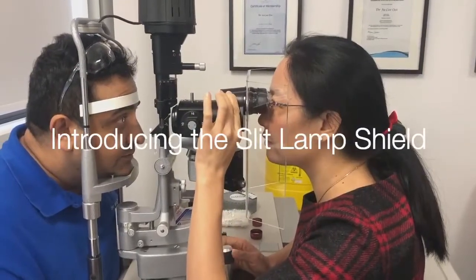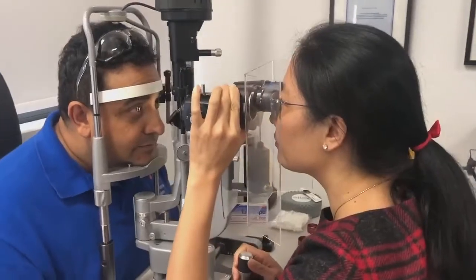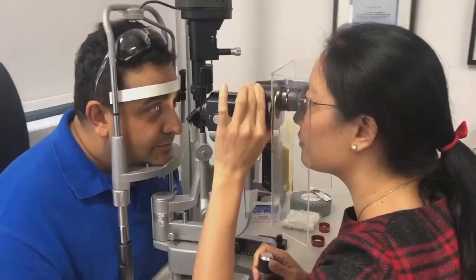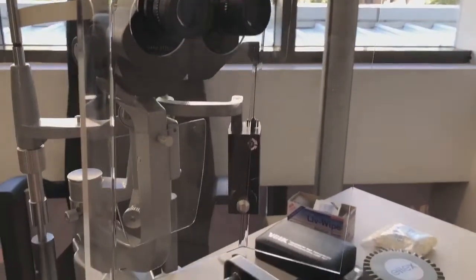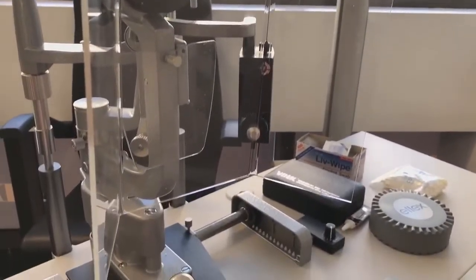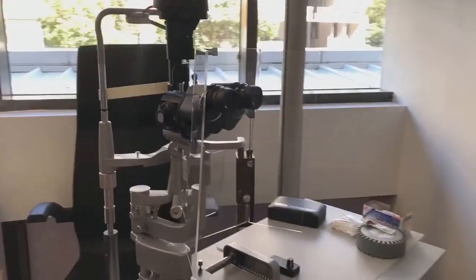Our slit lamp shields have been custom designed in Australia to protect eye health professionals from respiratory pathogens spread by droplet infection. It has a large surface area and angled side wings offering greater protection than other similar shields. It is manufactured in Sydney, Australia from clear acrylic.